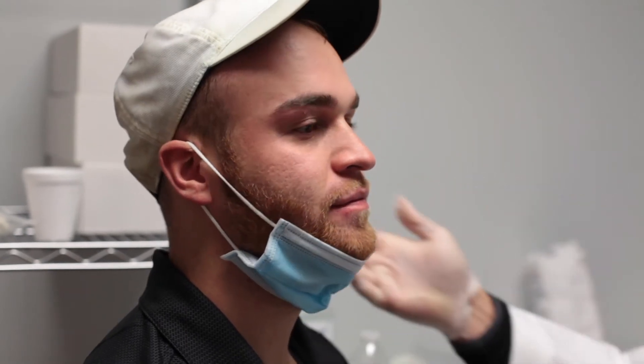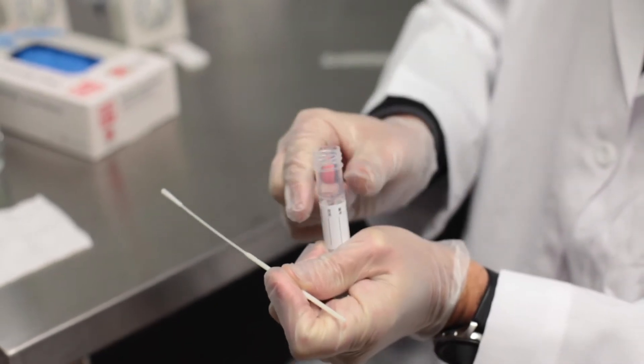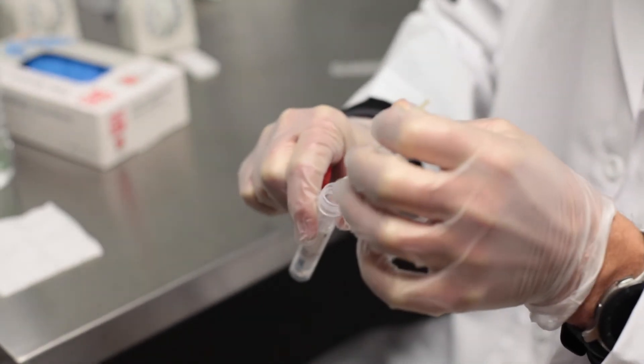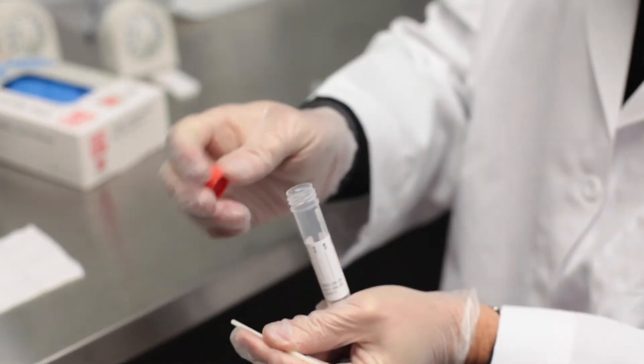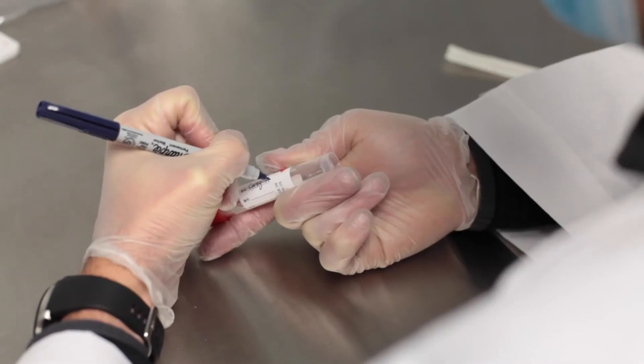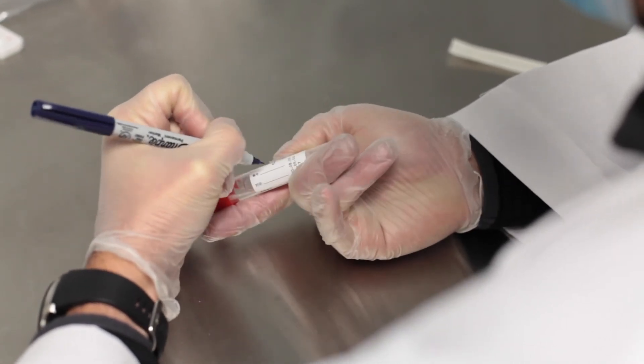Slowly and carefully remove the swab and dip the swab tip into a tube containing your viral transport media. Discard the tail of the swab and make sure to close the cap tightly. Label the tube with the patient's name, date of birth, and collection time and date.